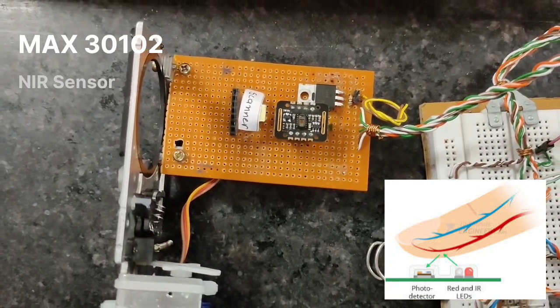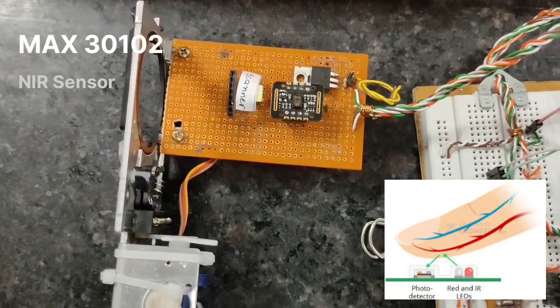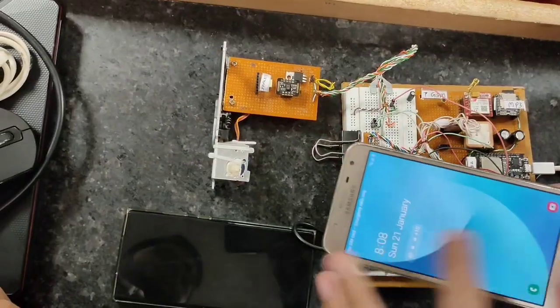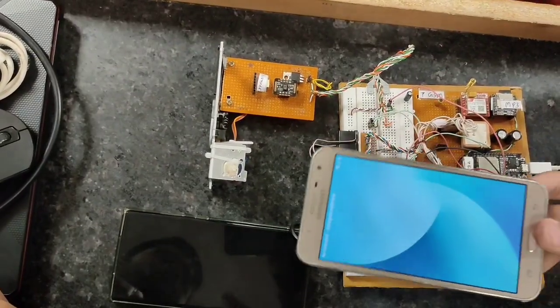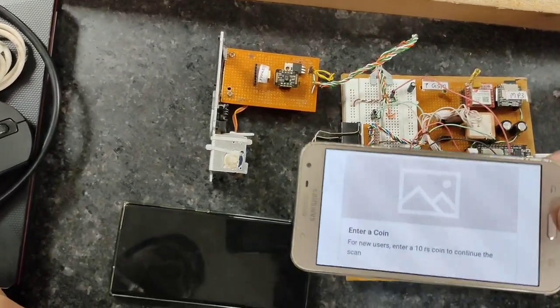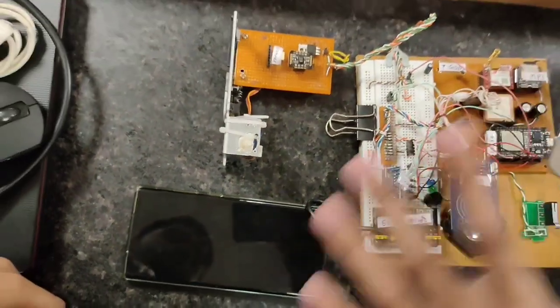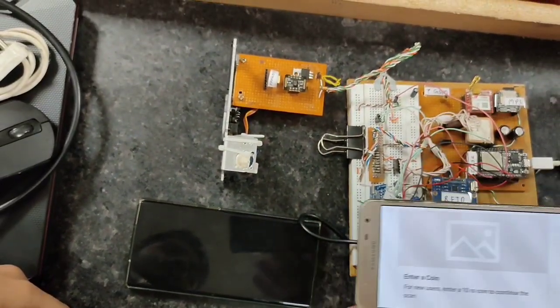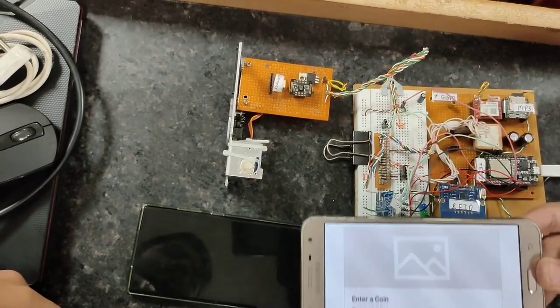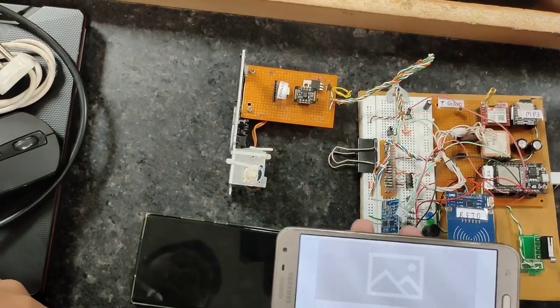We used an old phone to act as a display. You can see it shows 'enter a coin.' Basically we've showed the demo and everything is disconnected now, but I'll tell you how it's working.